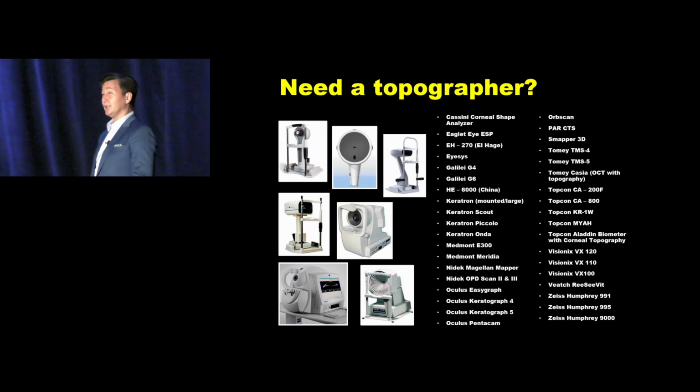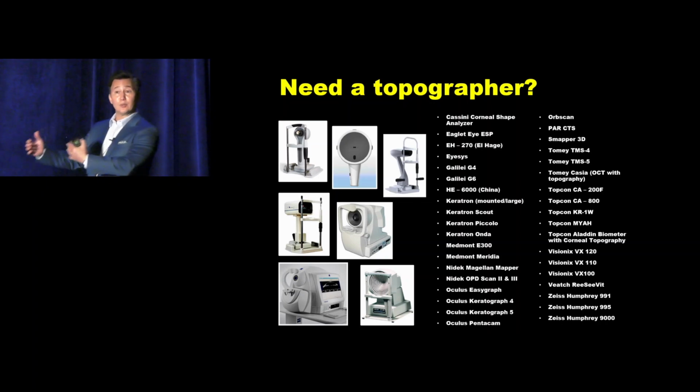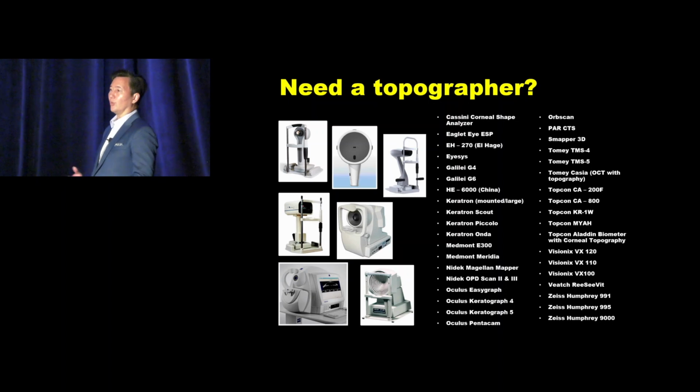Which is the best one? Each one has different strengths, so it may depend on your practice. Is your practice a little more surgically oriented? Then that may be a specific instrument for you. So you do ortho-k and you're doing a lot of disease work, then maybe it's one topographer. If you're utterly specialty contact lens, it might be a different topographer. So related to ortho-k, what should you use?